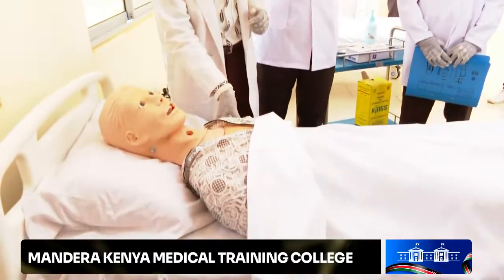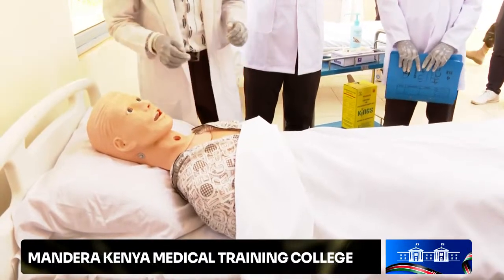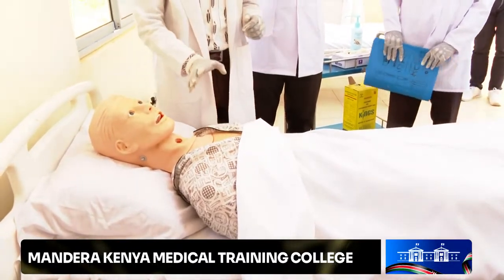IV, through the intravenous, we have oral drug administration. For the purpose of this demonstration, we're going to do IM, intramuscular drug administration. The sites of drug administration for IM, we have got three parts: one at the deltoid region, at the thigh, and then at the back, the gluteal one.